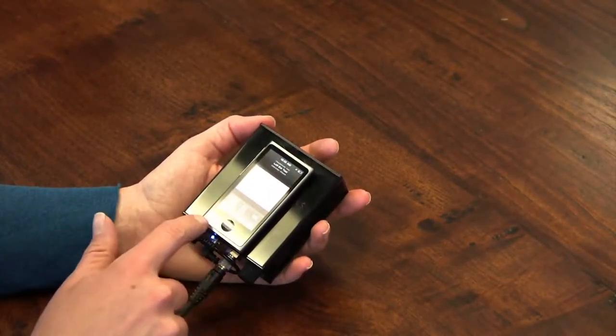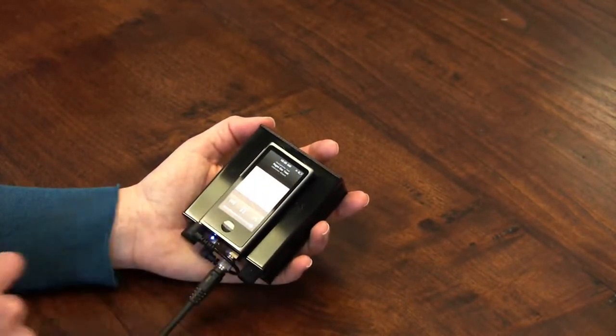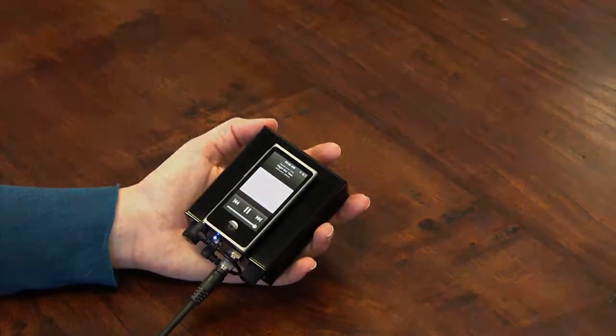Once you have confirmed that the left ear is working, press the back arrow or swipe your finger to the right to get to the previous menu. Then use the right ear test to confirm that the right ear is working properly.